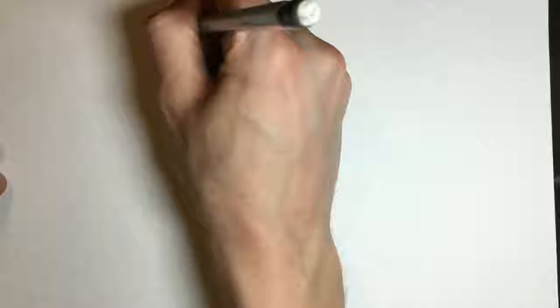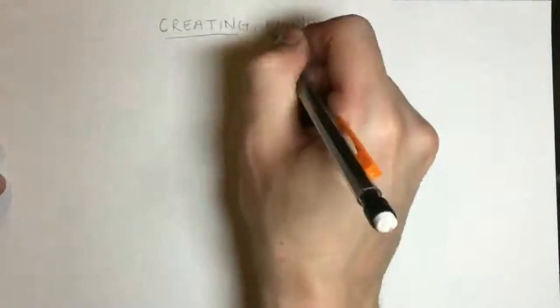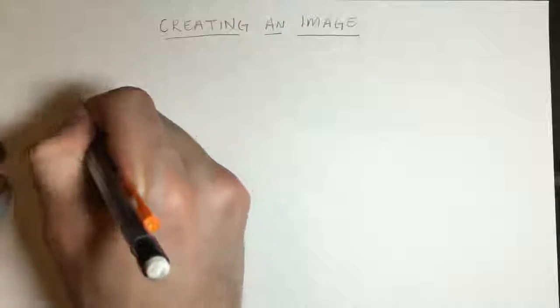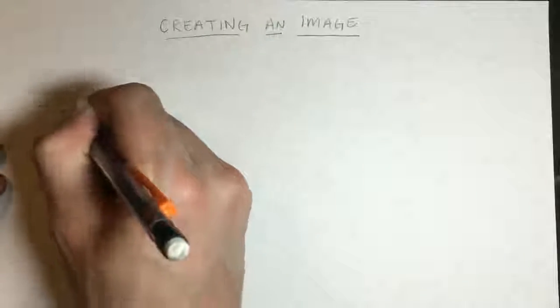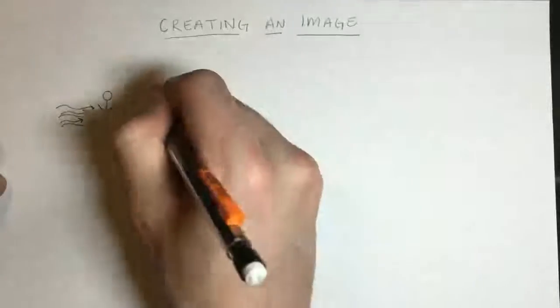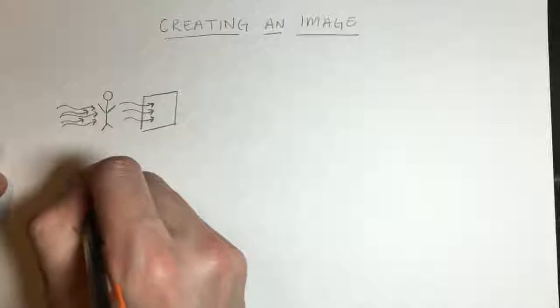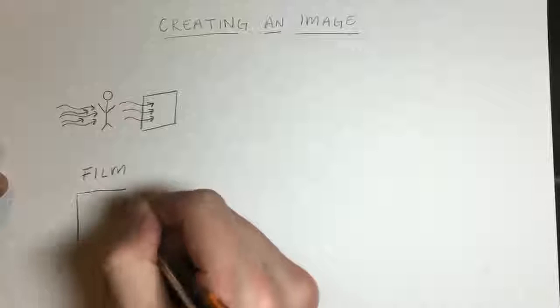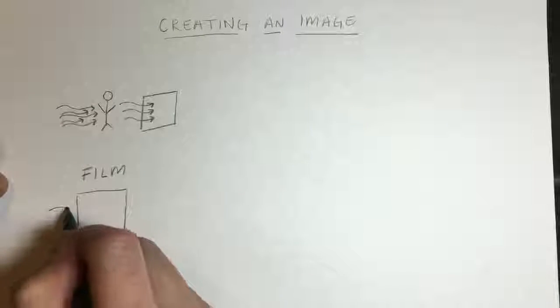So now we can move on to how an image is created using these mechanisms that we just saw. We know how the X-rays are produced. We know how they travel through the body. Now we're going to look at how they're actually producing an image on the other side with the screen. So we have two different sources of detection of those X-rays, and one is a film source and the other is a digital source. So the film is just detecting based on a chemical reaction that occurs.